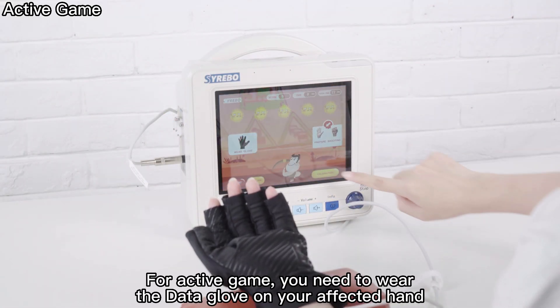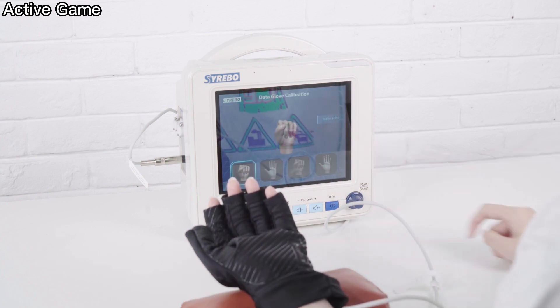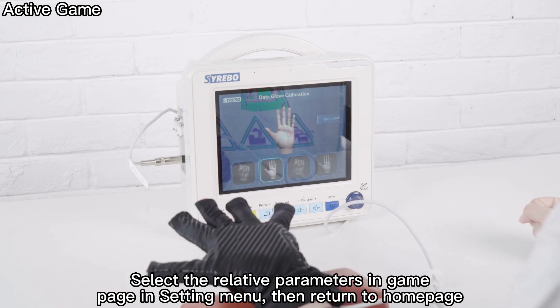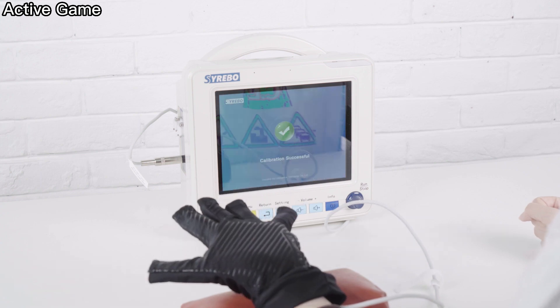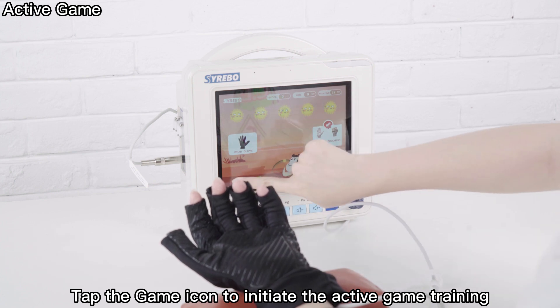For active game training, you need to wear the Data Glove on your affected hand. Select the relative parameters in the game page in the setting menu, then return to the home page. Tap the game icon to initiate the active game training.